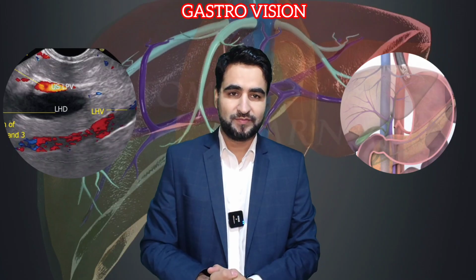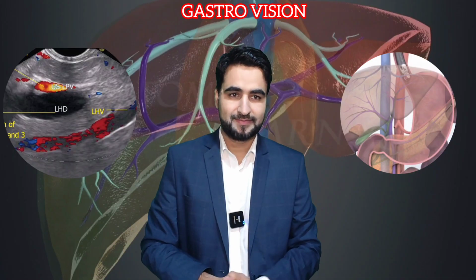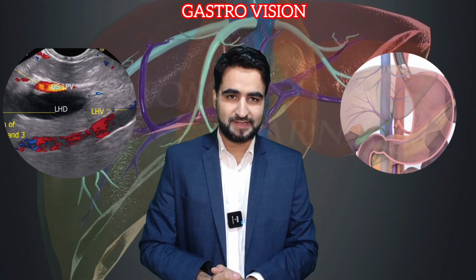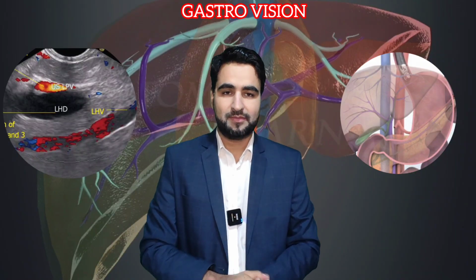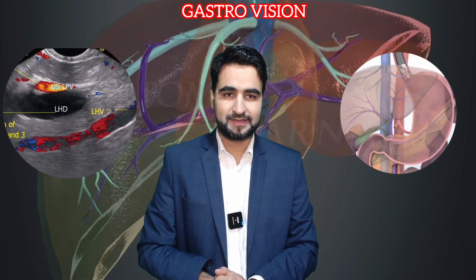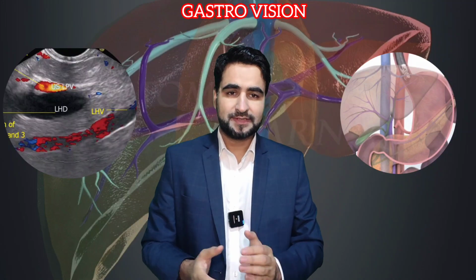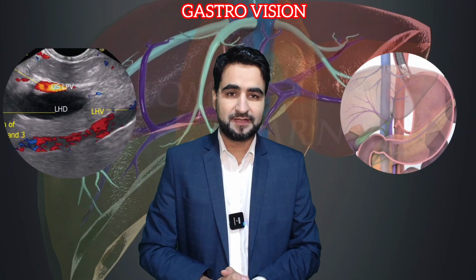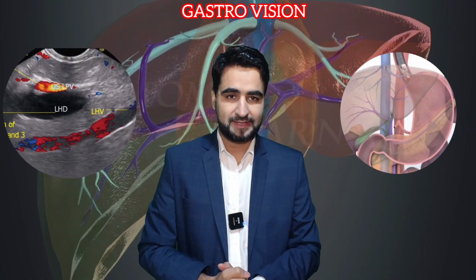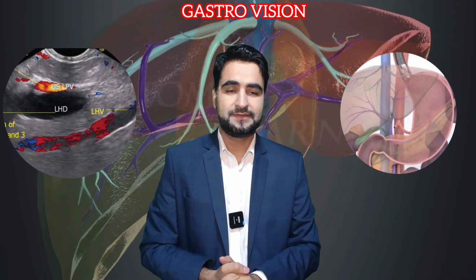In today's video, we will be exploring one of the most important anatomical regions in endoscopic ultrasound, the biliary hilum. We will start by moving step by step to identify the portal vein, common bile duct, and caudate lobe. Before analyzing how the two limbs of gastrohepatic ligament and hepatoduodenal ligament appear on endoscopic ultrasound, we will also discuss how these structures can interfere with biliary imaging, why acoustic shadowing or dropout may occur near the ductal confluence, and how to optimize your imaging technique to overcome these challenges.